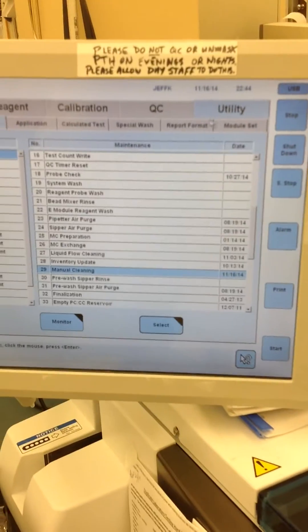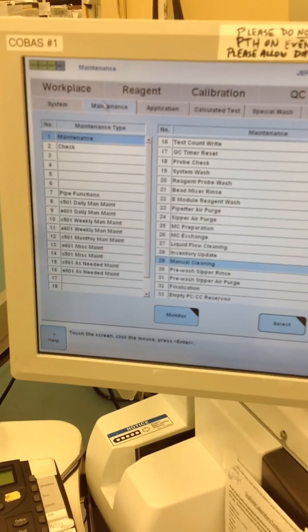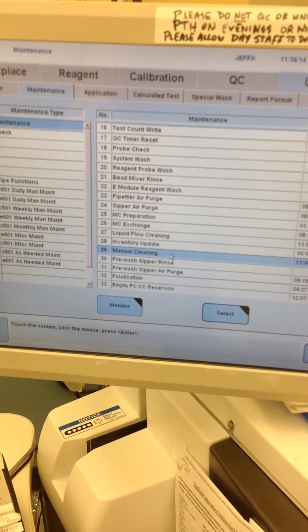Before we do the 601 — which I've already done — you want to go to Utility, then Maintenance, and then you want to put it on a manual cleaning. I've already done that just for the interest of time.